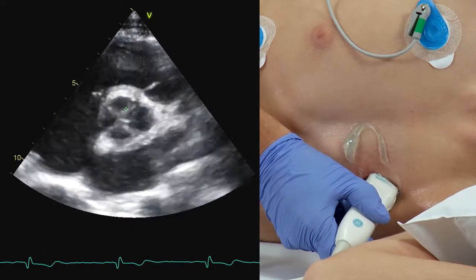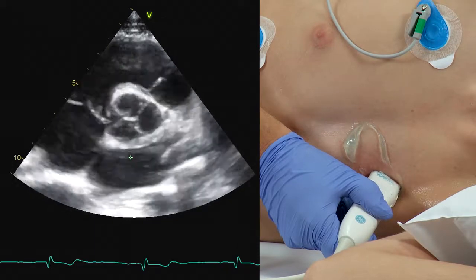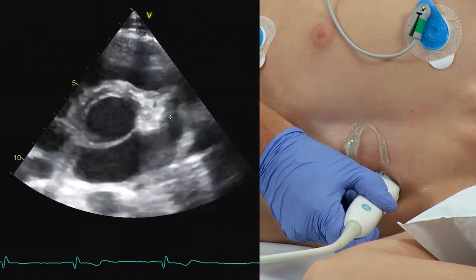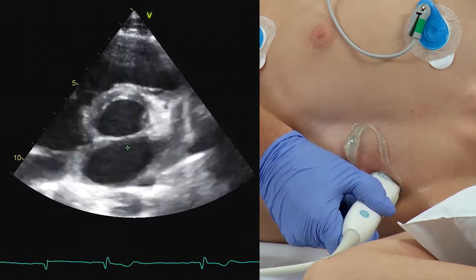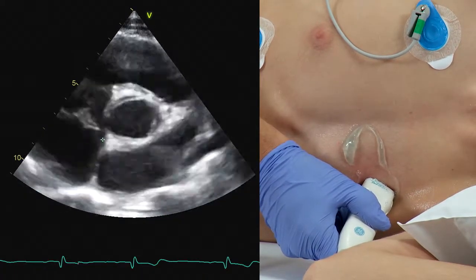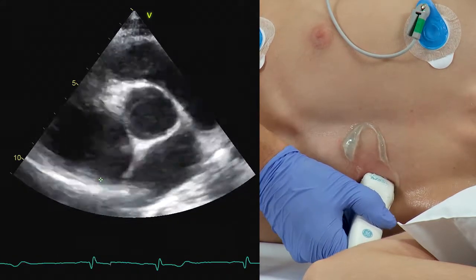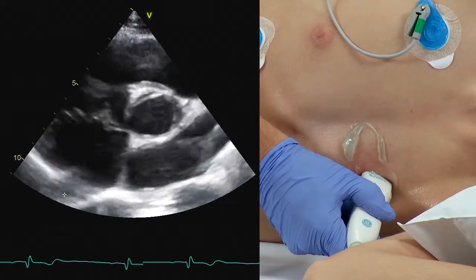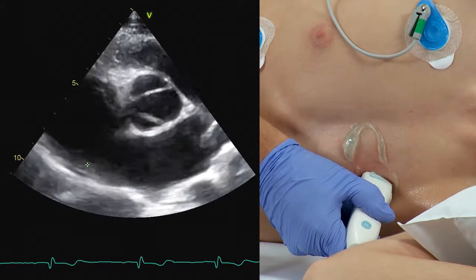But now, showing you the other structures you see. This is the left atrium. If you tilt the transducer a little bit more caudal, you can see the left atrial appendage here. And if you move the transducer back, it's very nice to identify the intraatrial septum. If you turn to the right atrium and move the transducer a little bit more, focusing on the right atrium, you can also see the IVC as it enters the right atrium.